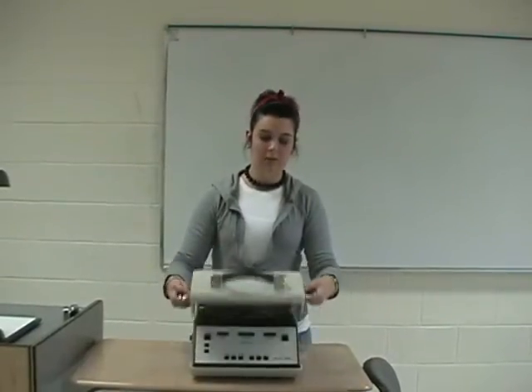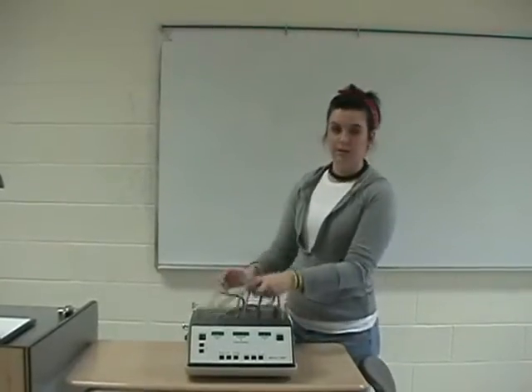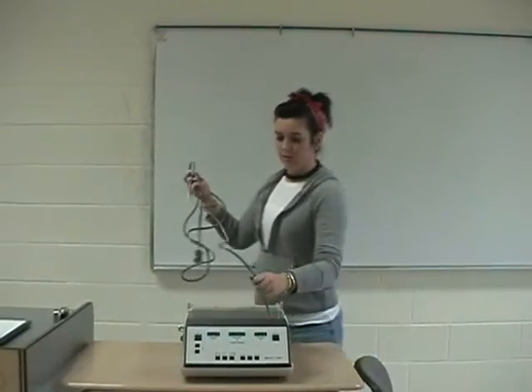Welcome, Intro to Audiology students. This is your guide to using the pure tone audiometer. First, you open it by unhooking the clips, and inside is all your cords, your earphones, and all the plugs.